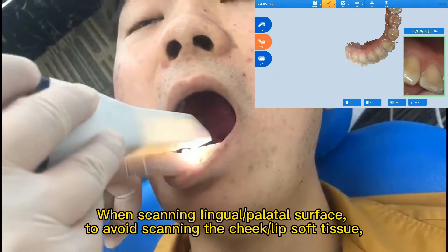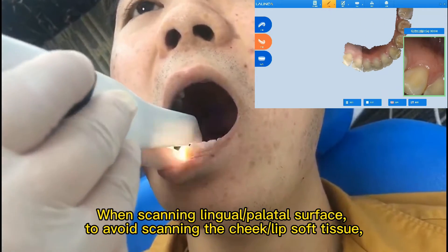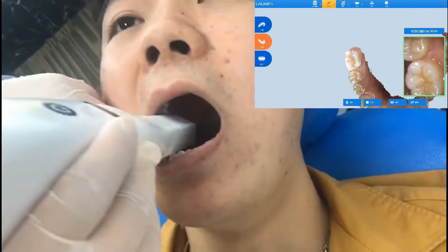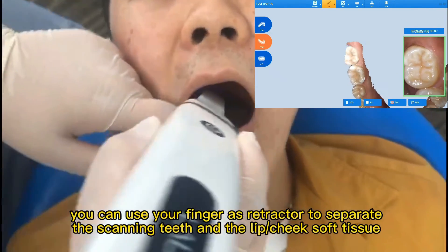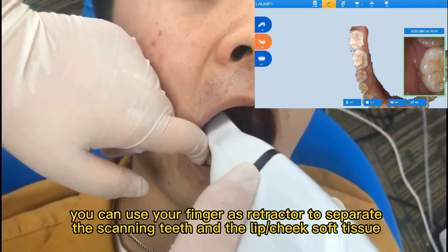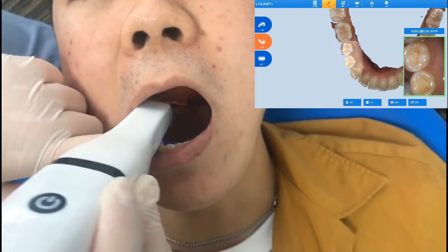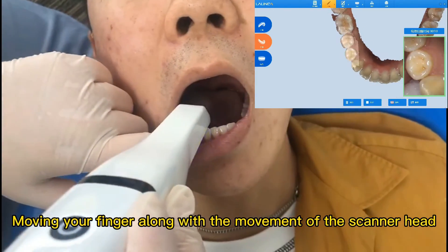When scanning the lingual and palatal surface, to avoid scanning the cheek and lip soft tissue, you can use your finger as a retractor to separate the scanning teeth from the lip and cheek soft tissue. Move your finger along with the movement of the scanner head.